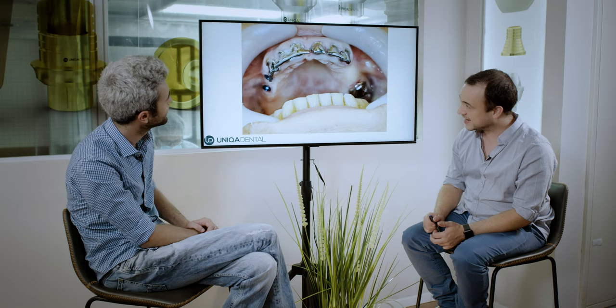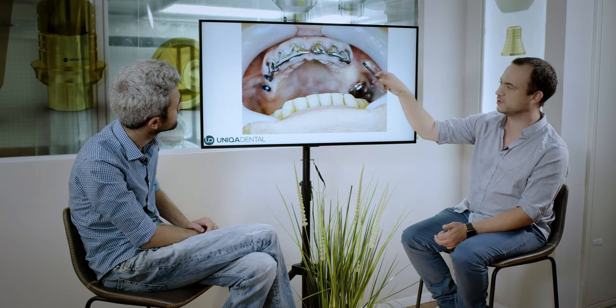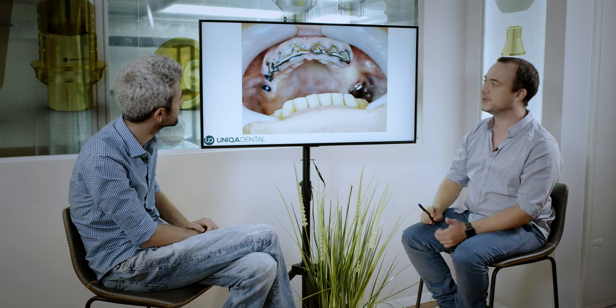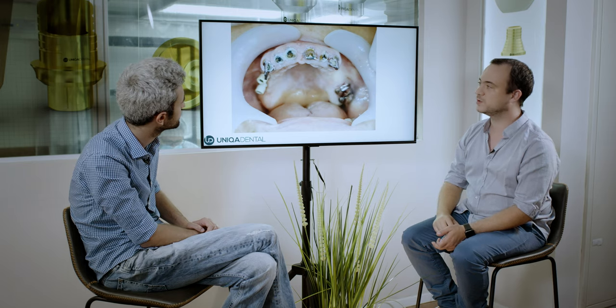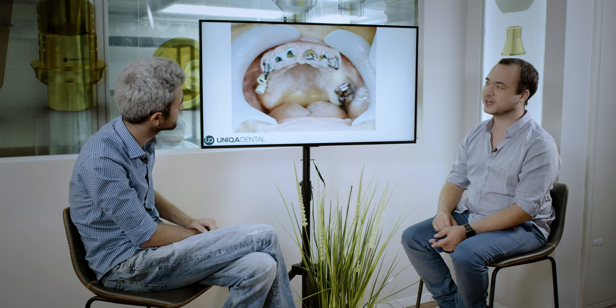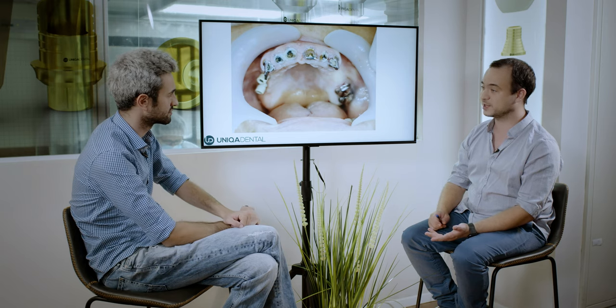Here you can see the bar — we took out this part of the bar and cut between the teeth. So everything we needed to extract, we extracted right here. Here you can see the teeth without the bar. The next stage was extracting the teeth. You can see scan abutments — the impression was originally taken with the scan abutments, so the surgical guide relies on the scan abutments also to hold them in position.